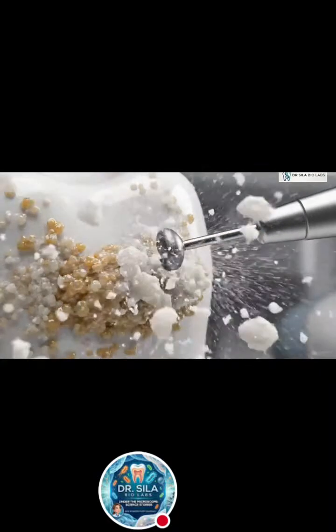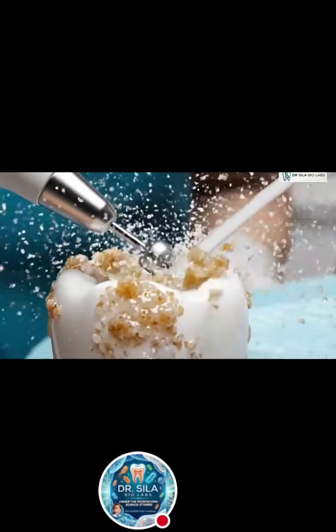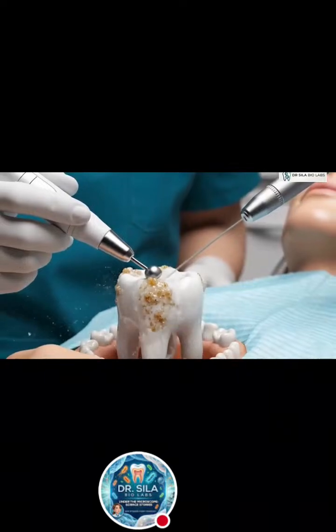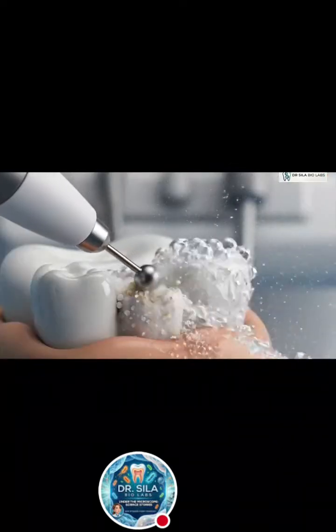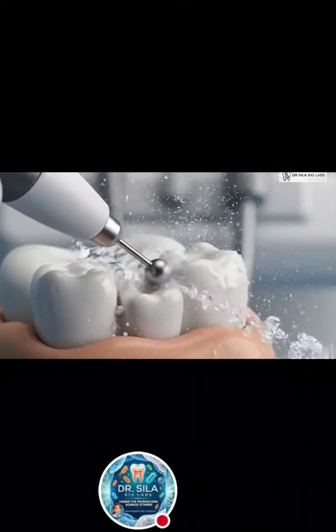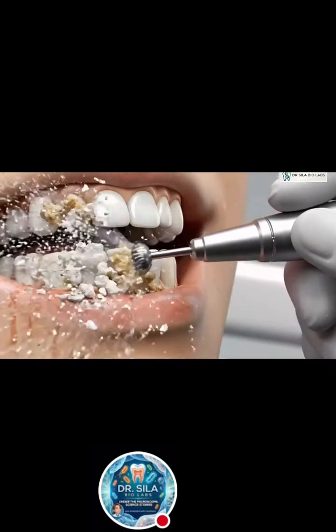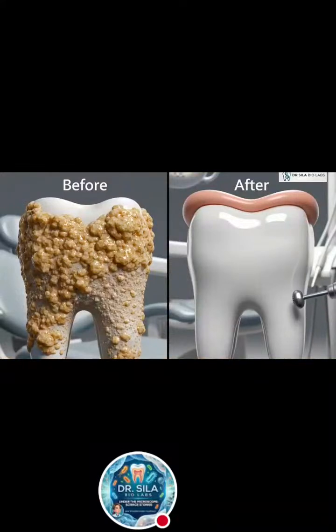The hardened tartar gradually breaks apart and detaches from the tooth. A stream of water is delivered at the same time. This water helps cool the instrument and flush away loosened debris. The combination of vibration and water can also help reduce bacterial buildup. Large deposits can often be removed quickly. The result is a cleaner tooth surface and improved access for further treatment.